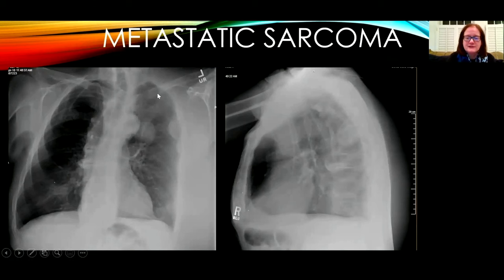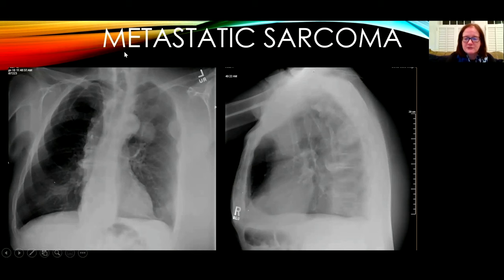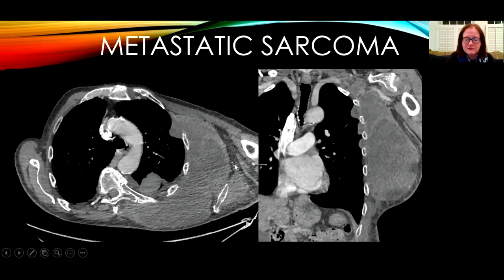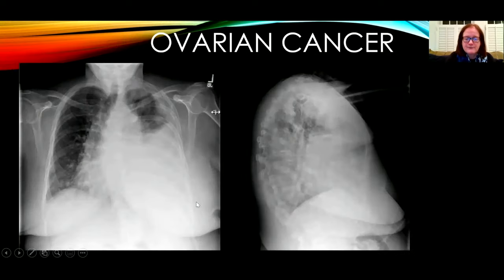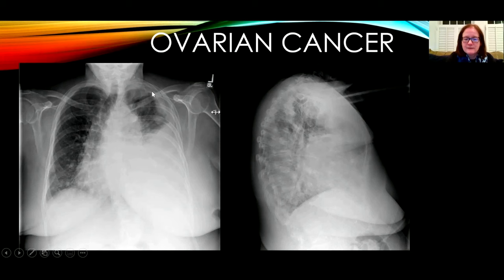Most pleural implants arise from metastatic lesions from cancers elsewhere, as opposed to primary pleural neoplasm. This patient with metastatic sarcoma had a large left chest wall mass, pleural implants on the left side, and pulmonary nodules and masses. A CT with contrast shows the left chest wall mass, and on the coronal view the pleural implants and lung nodule are visible. Another patient with metastatic ovarian cancer has a large left pleural effusion displacing mediastinal structures to the right, with bilateral lung nodules and nodular pleural thickening consistent with implants.